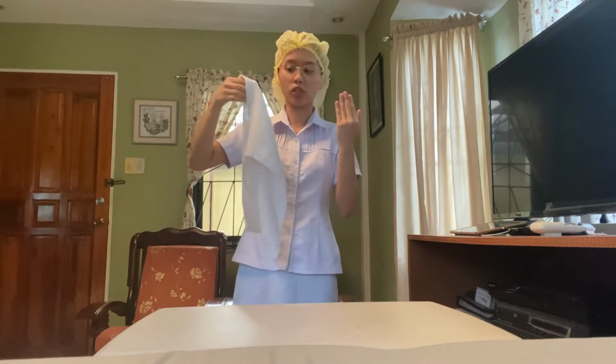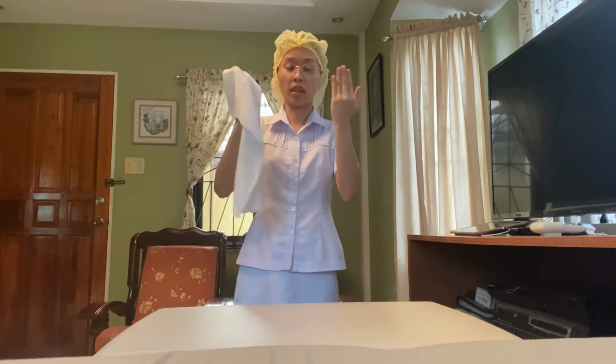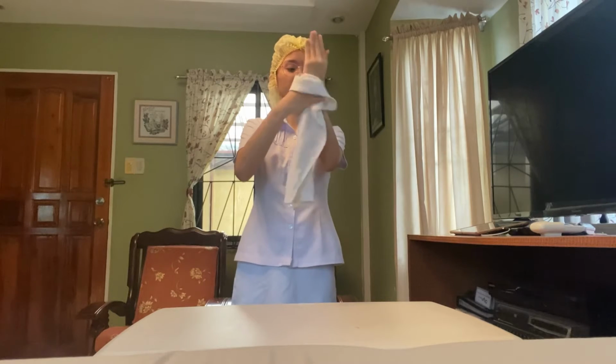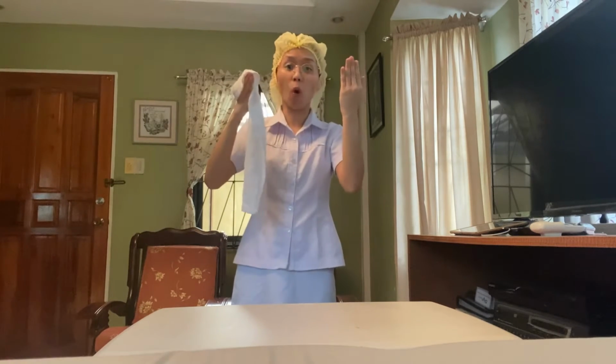So after scrubbing our hands, we need to completely dry our hands. So we start first with the fingers, wrist, forearm, down to the elbow. And make sure not to go back and forth.